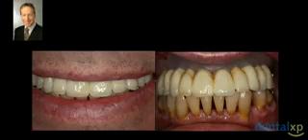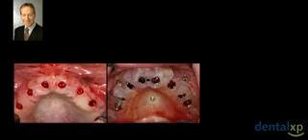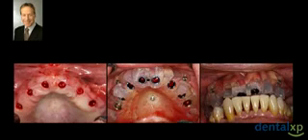So here we are now at the time of surgery. We're trying in the patient's final provisional restoration supported by the holder. We're removing the plugs where the osteotomy sites are going to occur. We're using the same related technology that you've seen case after case after case. You can see the intermaxillary relationship. We've left some of the teeth on this particular appliance. We're always confirming that the intermaxillary relationship is correct.